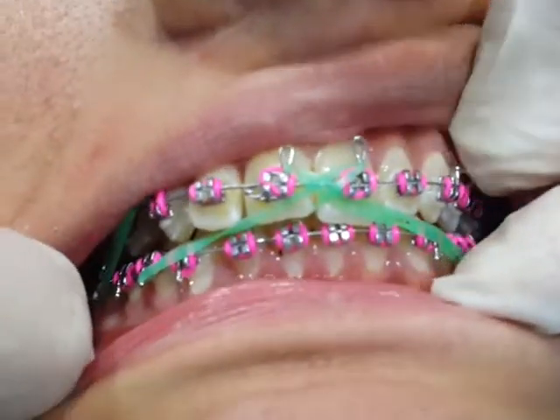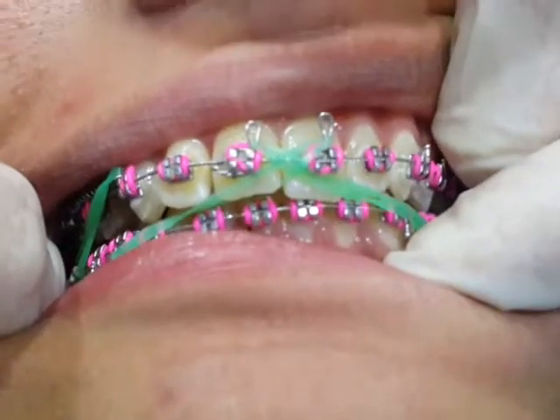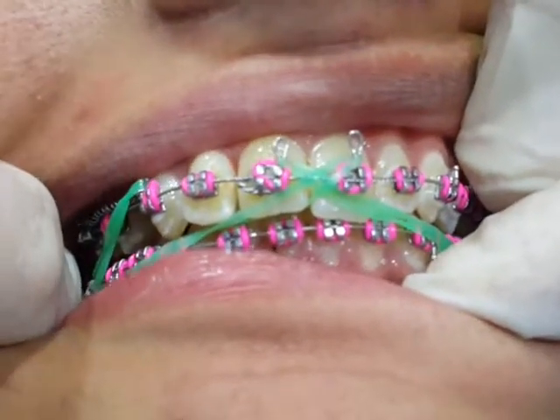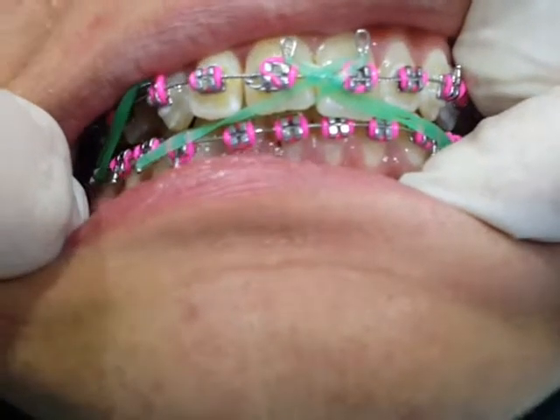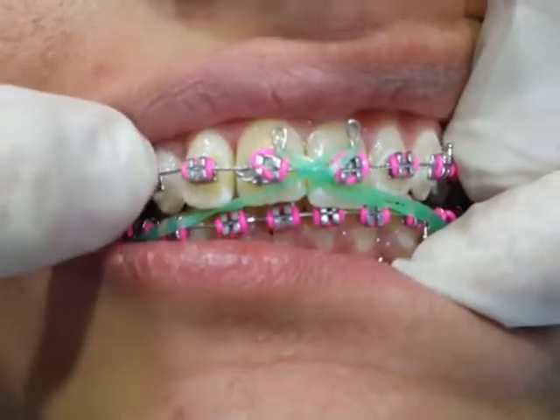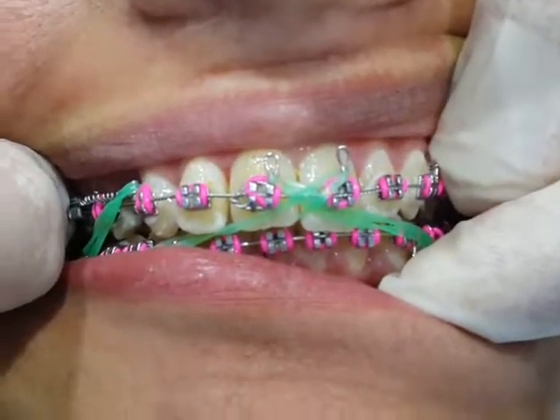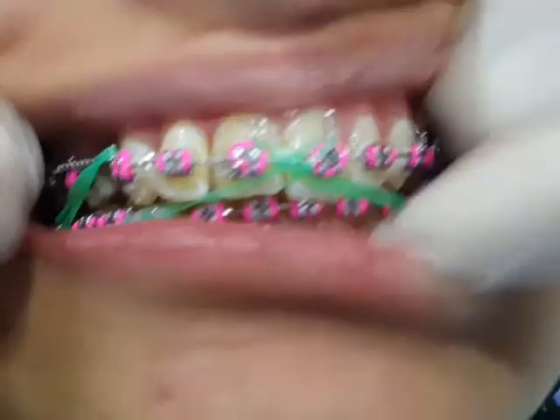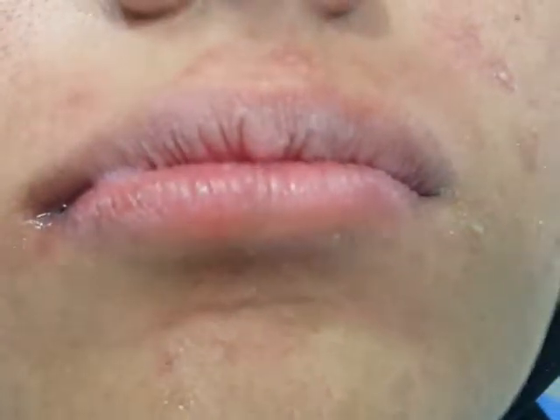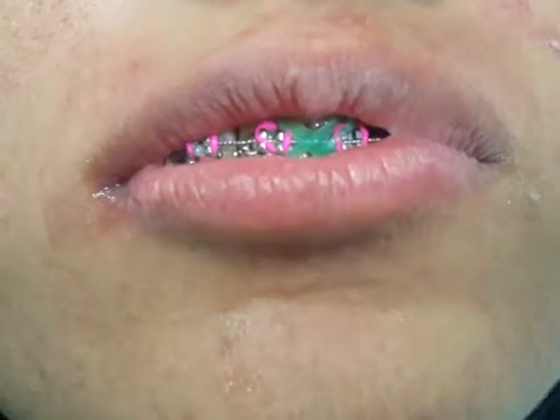As you can see the difference now — after only three months, we have reduced the overjet and relieved the crowding. The overjet was originally nine millimeters and now it is only five millimeters. In just three months, we retracted the canine and retracted the upper incisors by four millimeters, reducing the overjet. Therefore, the lips are now easily controlled and the progress is very rapid, and the patient is very happy thanks to the enjoyable dentistry — it is rapid and enjoyable at the same time.